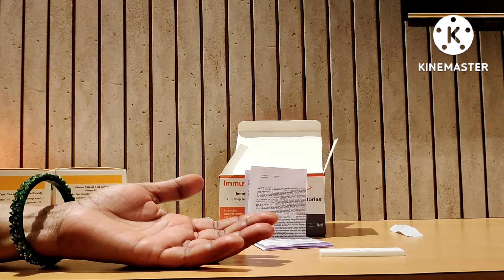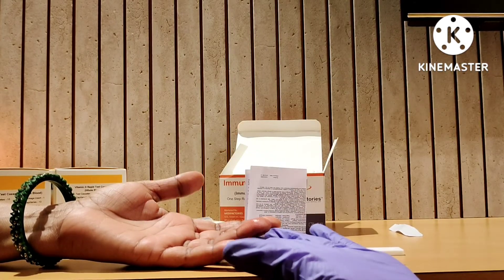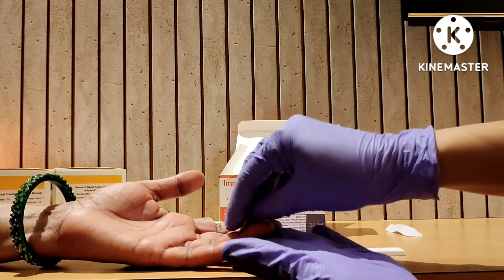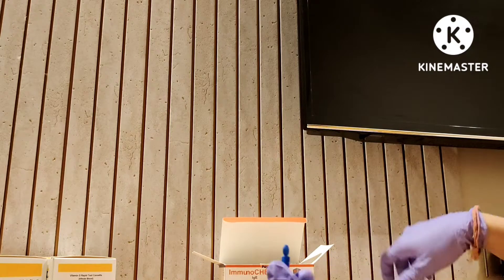With the help of an alcohol swab, first we have to sterilize the finger and then wipe out the excess alcohol. We are using a fresh lancet.